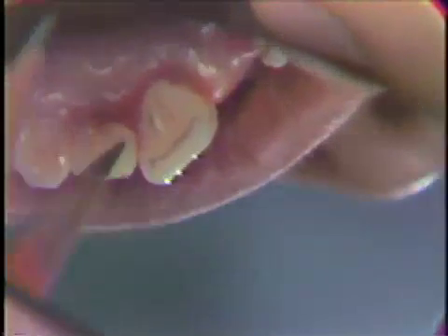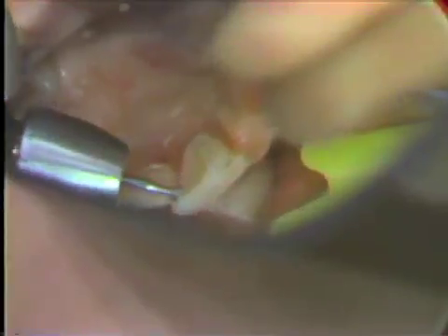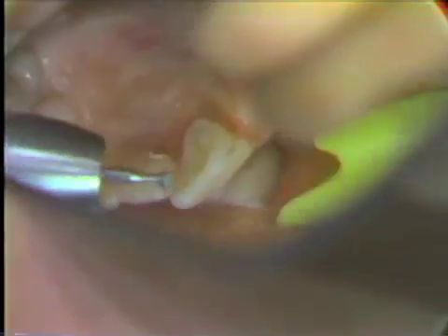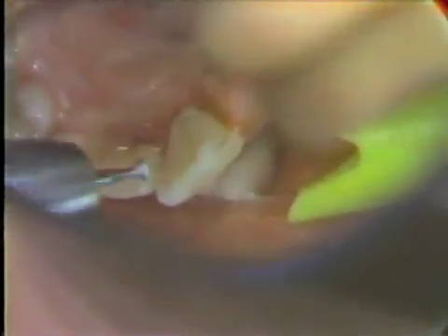We will outline the parameters of our preparation. This is the groove that we're going to place — a cingulum ledge — and this will show us where we're going to make our cuts. Go all the way up to the inside of the ledge. You have to be careful that you don't make this groove too deep in the inside of the ledge area, or else that gold is going to show through.